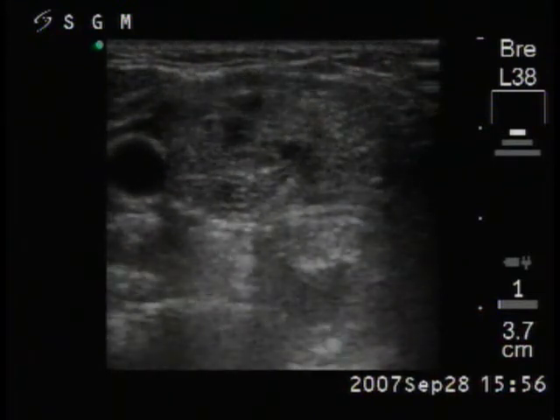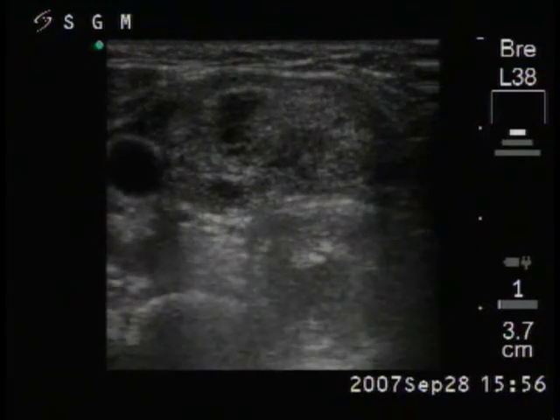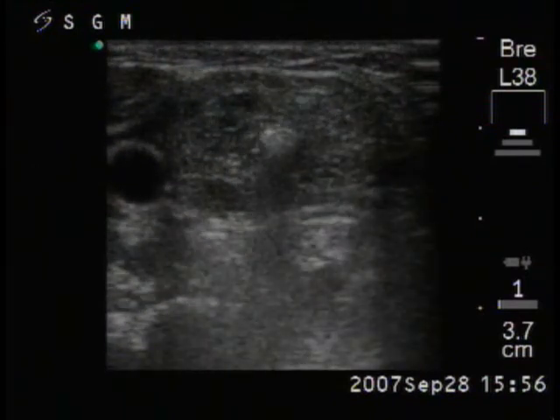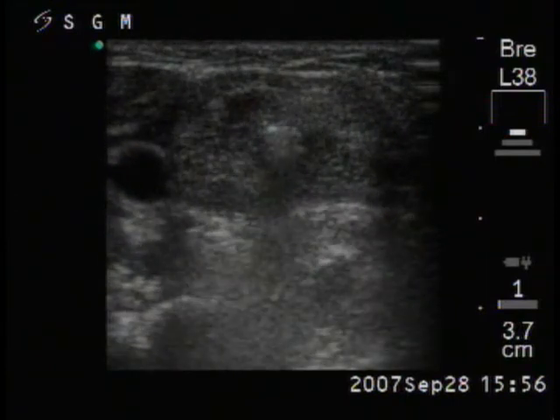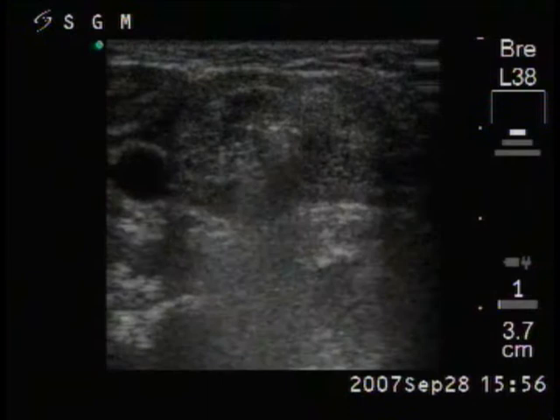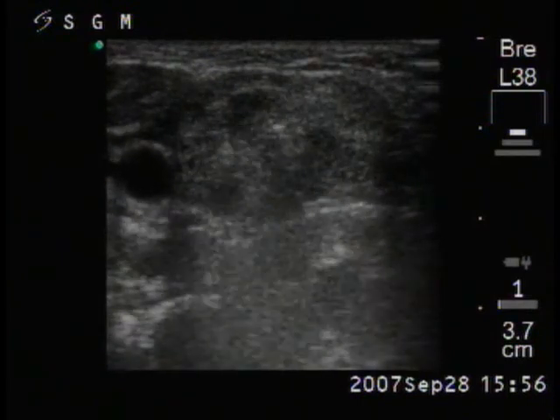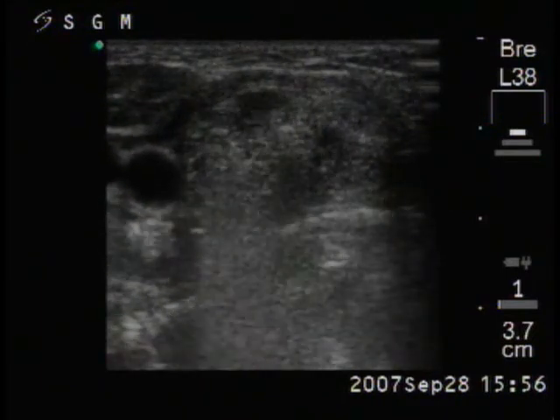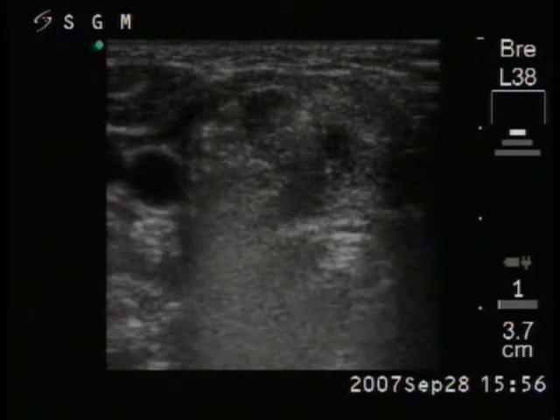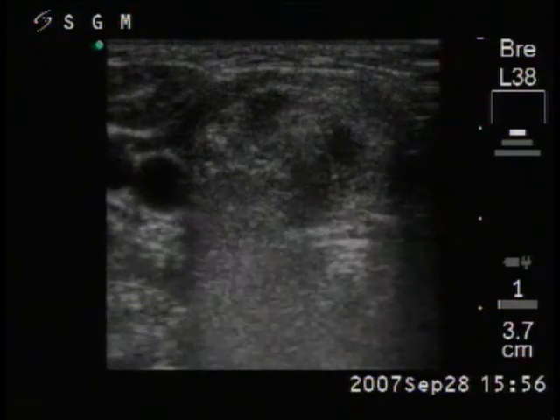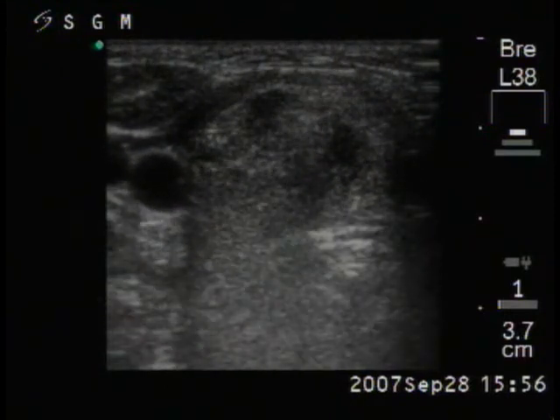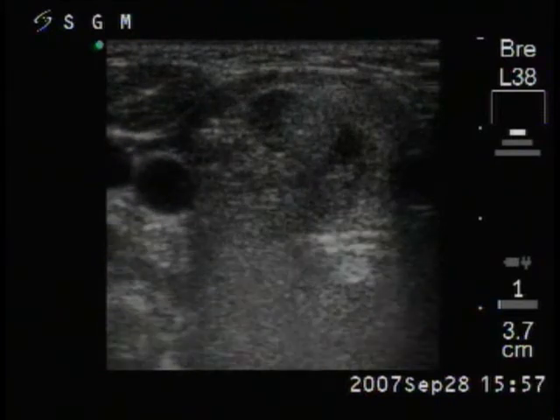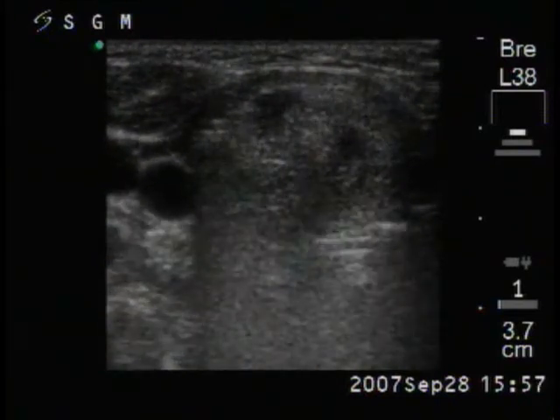The needle is located in the central part of the nodule and we start with the alcohol ejection. The alcohol is injected into the middle of the nodule (red arrow), while there are signs of flow in the lateral part of the lobe (green arrow). The latter is probably caused by lymphatic drainage.